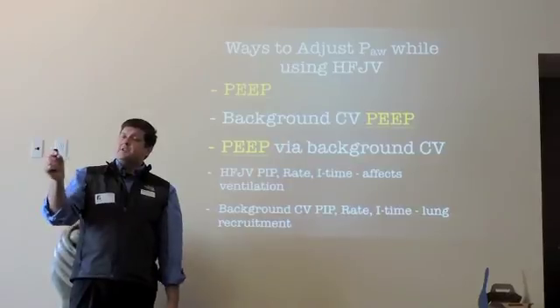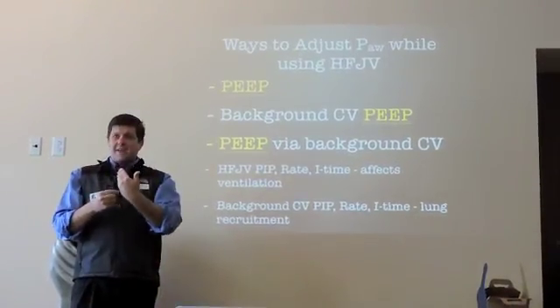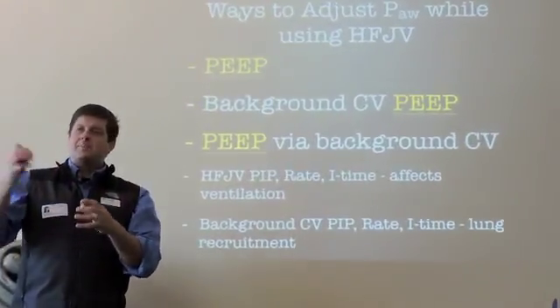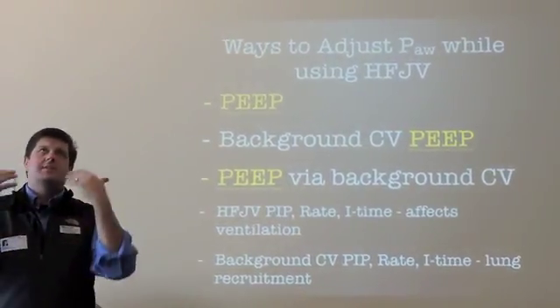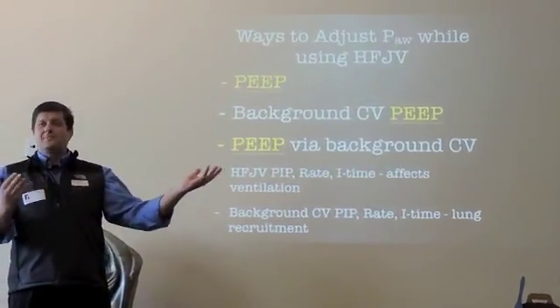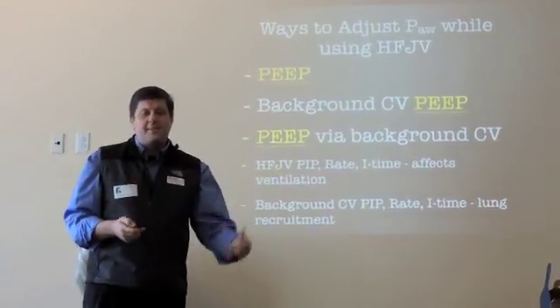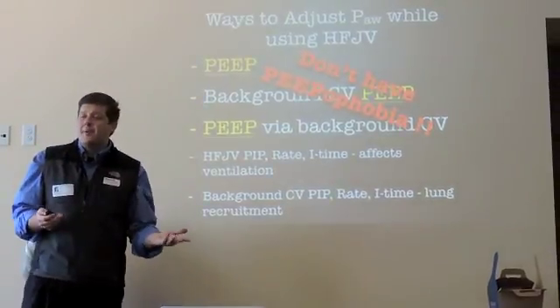When you adjust the mean adjust knob on an oscillator, what are you manipulating? The exhalation diaphragm, that mushroom diaphragm on the end of things. When you increase mean, the diaphragm expands more and creates more resistance. It's PEEP. It's the same thing. They're just cool enough because they don't have PEEP as a display for you to read. Okay, we do. So take a piece of tape and cover the PEEP display, and then there you go. You don't have PEEPophobia.